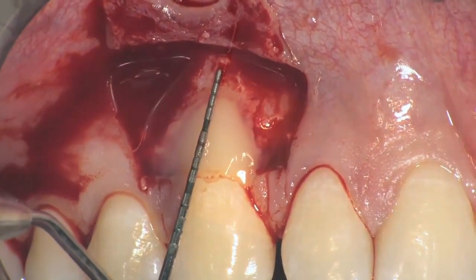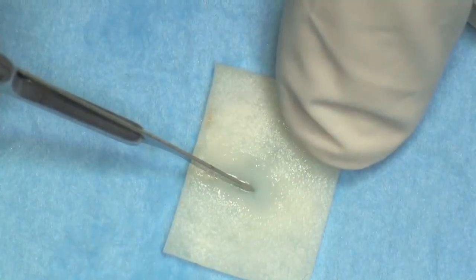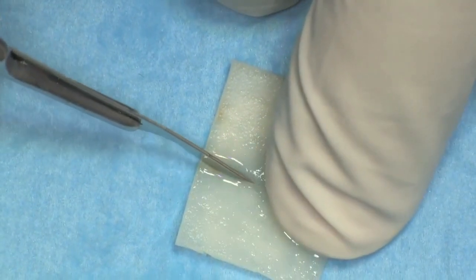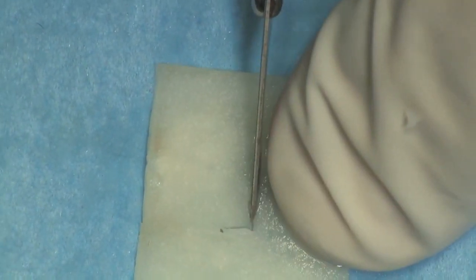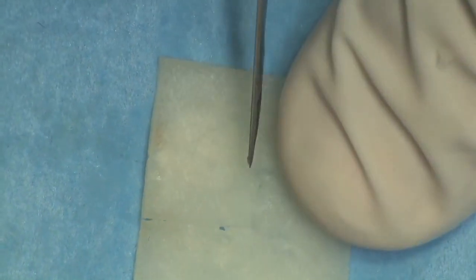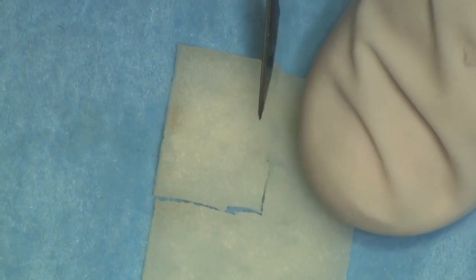Measurements are made to establish the required dimensions of mucoderm. The height of the mucoderm should be 3 mm more than the height of the root exposure, while the width of the mucoderm should be 6 mm more than the recession width measured at the cemento-enamel junction. The mucoderm is then cut with a blade.